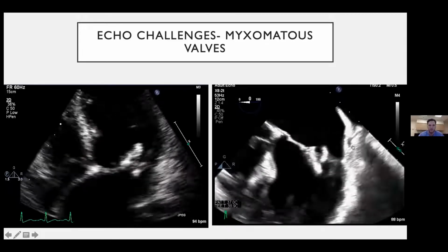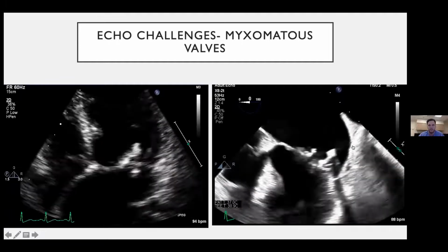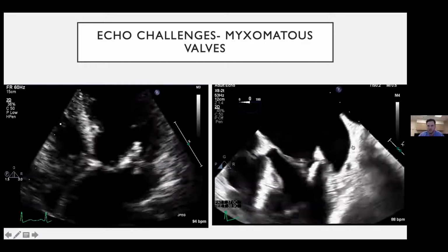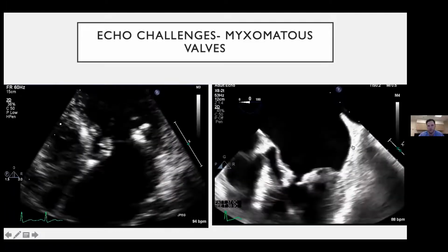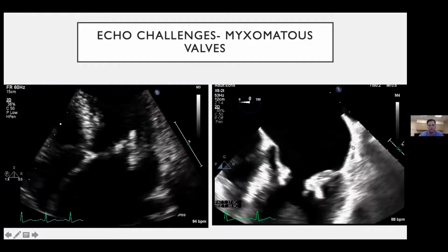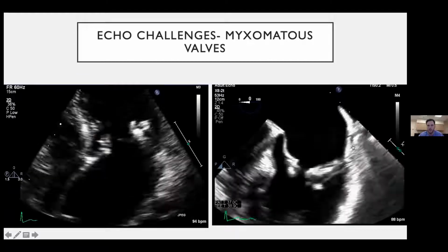As an example, this patient had a myxomatous mitral valve and had recurrent bacteremias. The transthoracic is seen on the left and the TEE is seen on the right. And you can see bileaflet prolapse with probable posterior leaflet flail and significant thickening and redundant tissue. There's at least one echo density with independent mobility, but is it vegetation? Is it just redundant leaflet tissue? You really can't say based on these images, even with a TEE. So even a TEE was not really that helpful here compared to transthoracic in sorting it out.